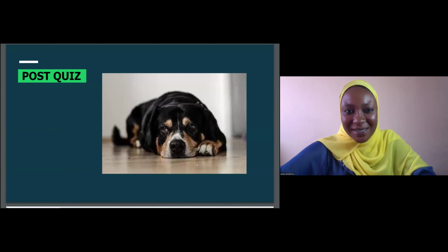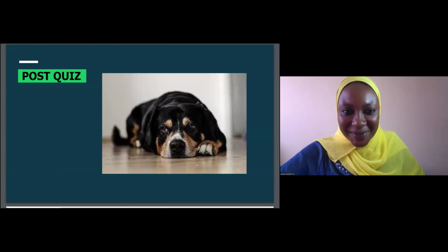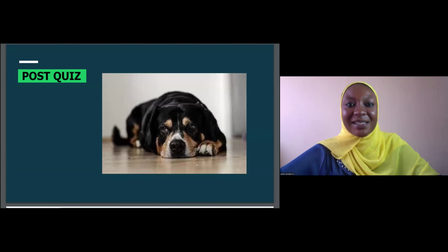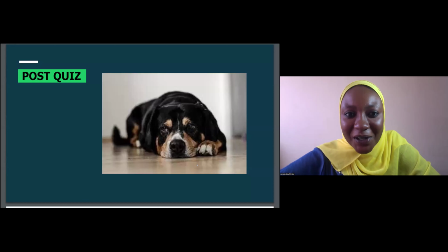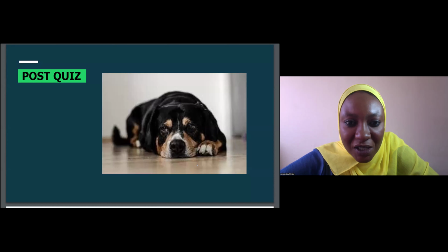Okay, let me just read out the questions, and then you kindly answer the questions for us. Number 1 says, which of the following statements in relation to dual energy X-ray absorptiometry, DEXA scans, is correct? A lot of people got 17/17, 100% answered. A, an initial DEXA T-score of below -2.5 is considered low risk and no further scanning is required in patients receiving ADT for prostate cancer. B, an initial DEXA T-score between -1 and -2.5 is classified as intermediate risk in patients receiving ADT for prostate cancer and requires further DEXA scan every year.